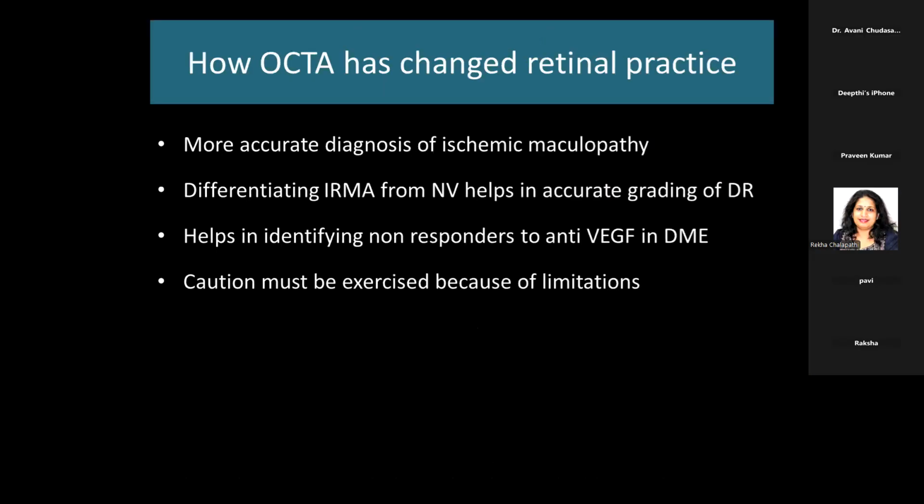But how OCTA has changed our practice, the most important thing is it can non-invasively detect most of the ischemic maculopathy. It helps to differentiate IRMA from the neovascularization. It helps us to identify who are the non-responders to anti-VEGF, which are the patients who require steroids. So caution must be exercised because there are a lot of limitations.